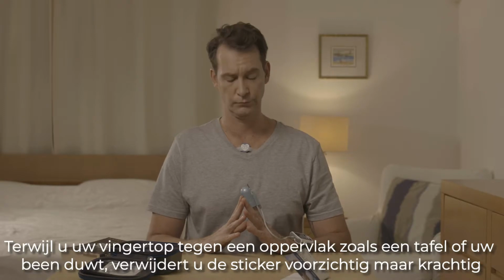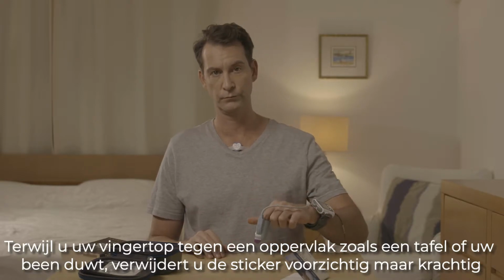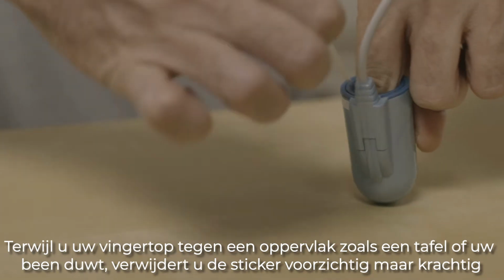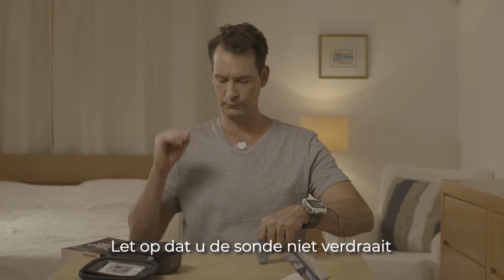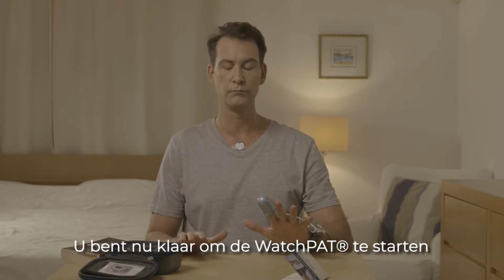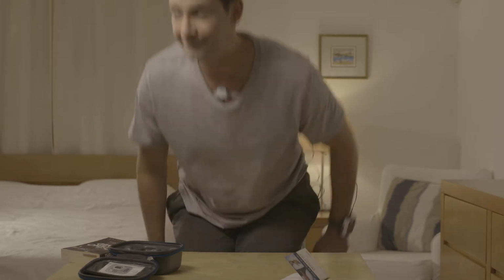While pushing your finger against a surface like a table or your leg, gently and firmly remove the tab. Be careful not to twist the probe. You are now ready to turn the WatchPAT on. Get into bed.